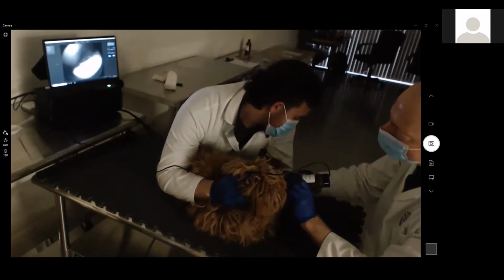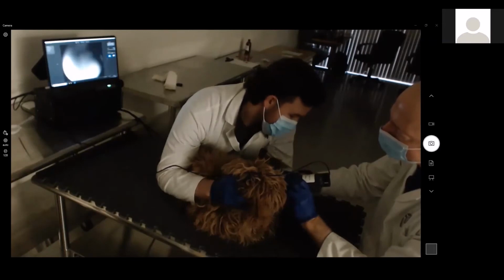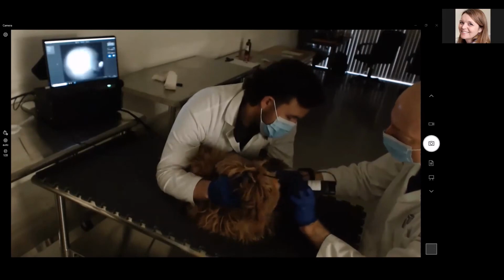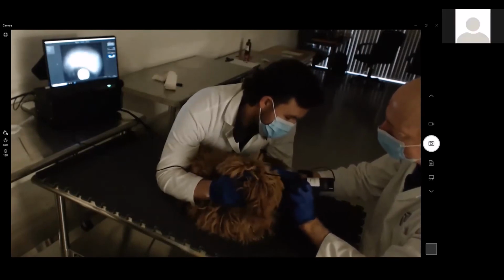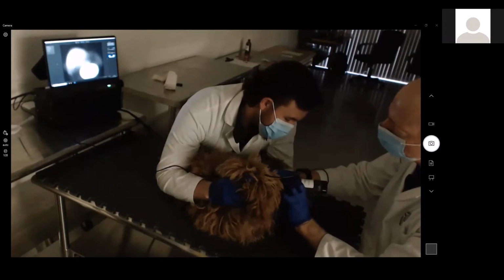There we go. Yeah, you got a little too much back reflection on this. You can't turn it down too much on this system. Yeah, I mean, we saw a little bit of nerve there for a second, I think. Yeah, there was optic nerve in there. We can review what we have as well. I took some pictures there.